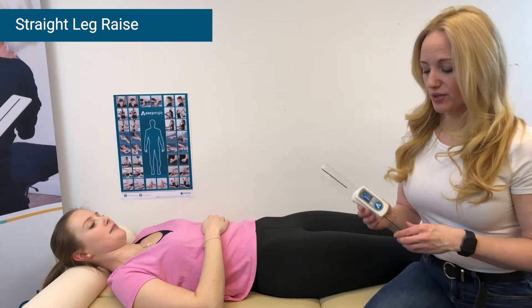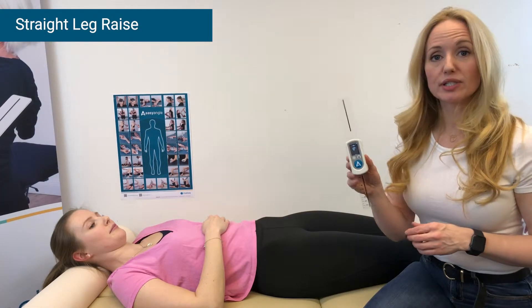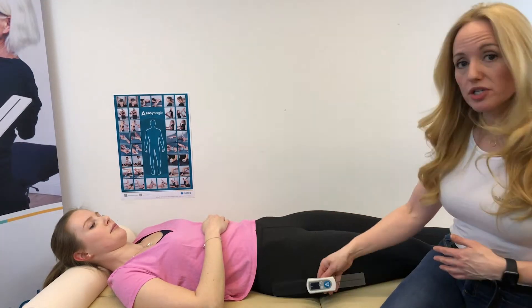In this Easy Angle video, we are going to demonstrate how to measure hamstring flexibility using the Easy Angle. To do this, we press the button to get our blinking zero, which tells us we're ready to set the plane of measurement. We want to measure against gravity here.